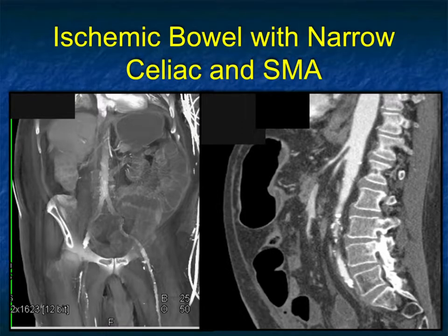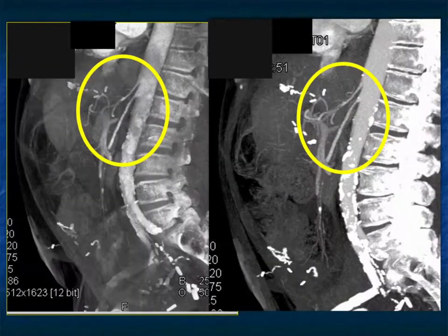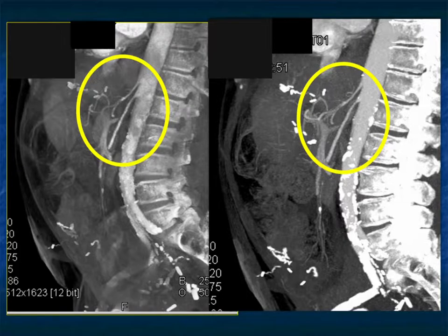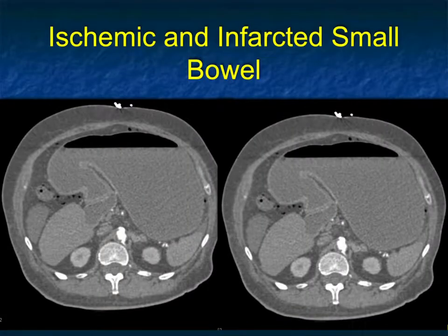Another thing to look at carefully besides vessel patency is vessel size. In this case of suspected ischemia, the SMA and celiac are both really tiny, as are their branches — a low flow state. When you see the SMA and celiac that small, that alone makes me say this is a low flow state and I'm worried about ischemia, even without vessel occlusion.